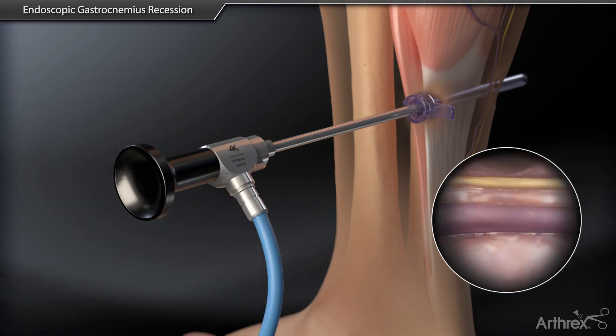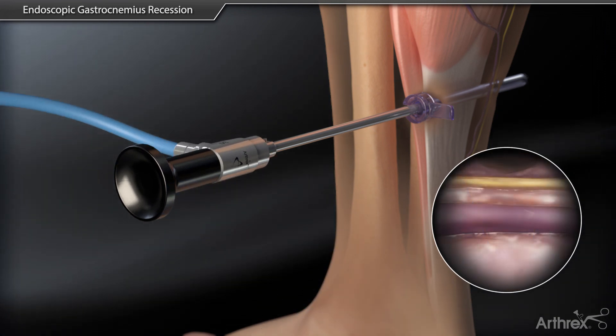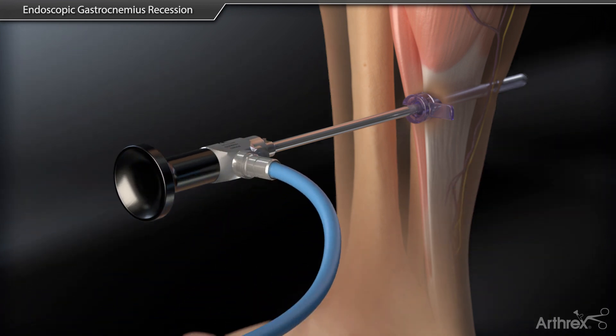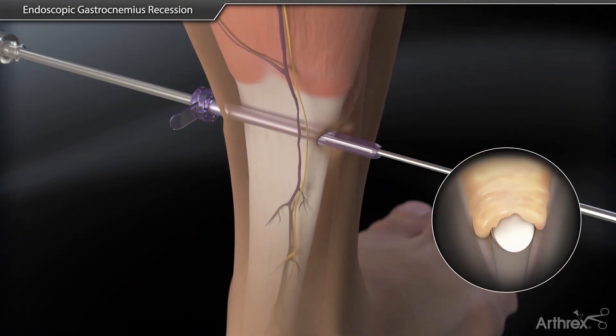In some instances, the camera can be aimed posteriorly to view the saphenous vein and sural nerve on the lateral half of the leg. If there is soft tissue overlying the gastrocnemius tendon, use a plane finder to dissect into the correct plane.